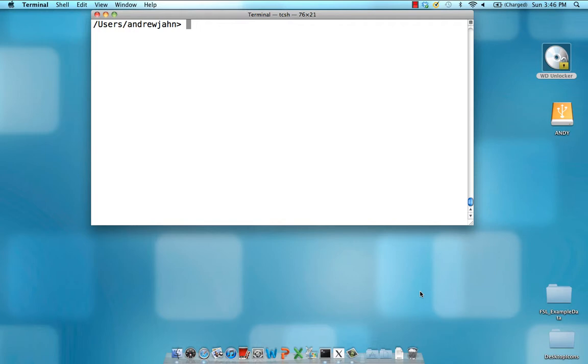So for example, there may be an acquisition order where each slice is acquired sequentially or where each slice is acquired every other slice. But the point is that each slice is temporally distinct from the others. So in order to rectify this, we need to do some interpolation to alter the time course and shift it so it's as though each slice was acquired at the exact same time.